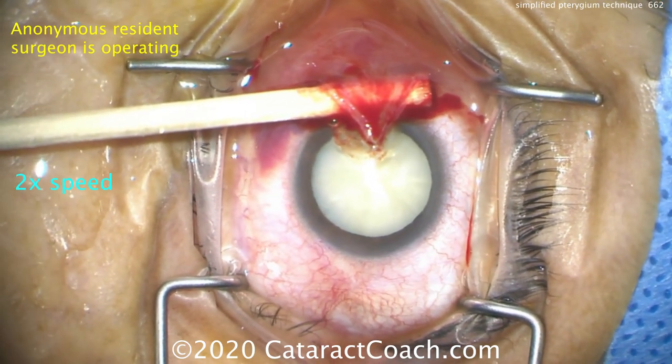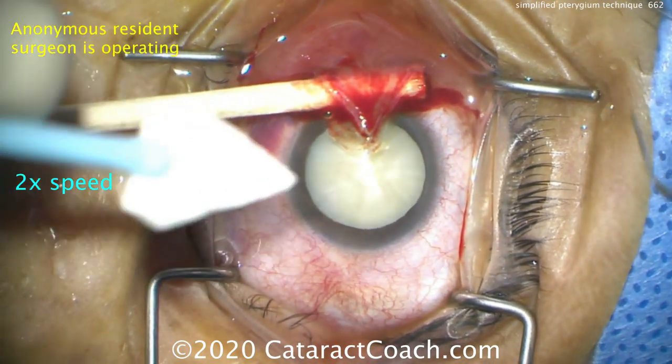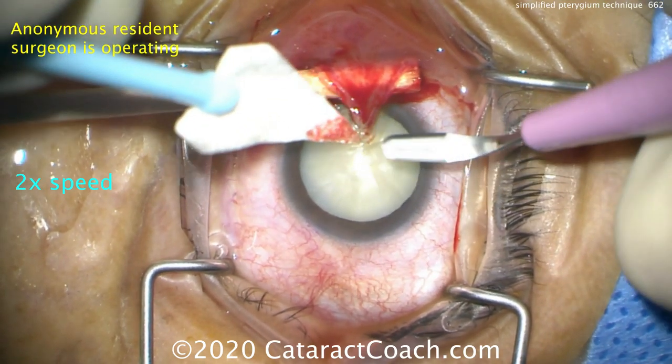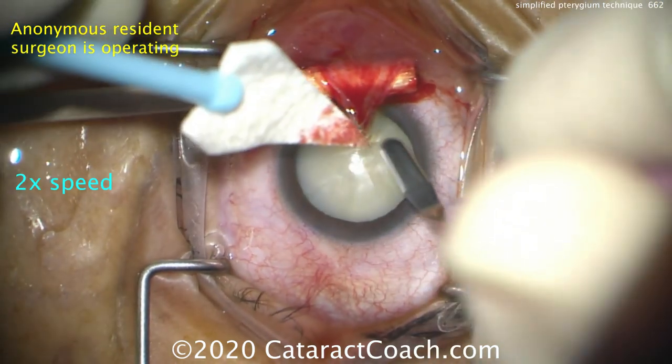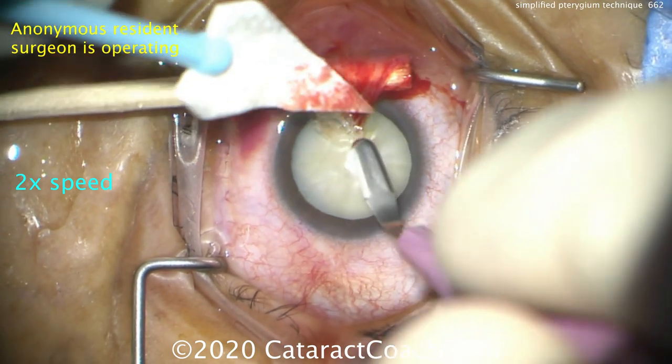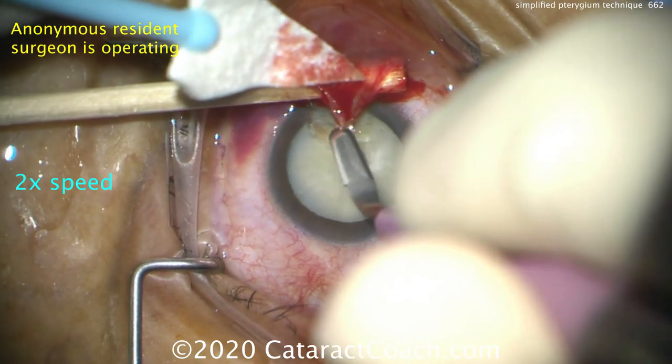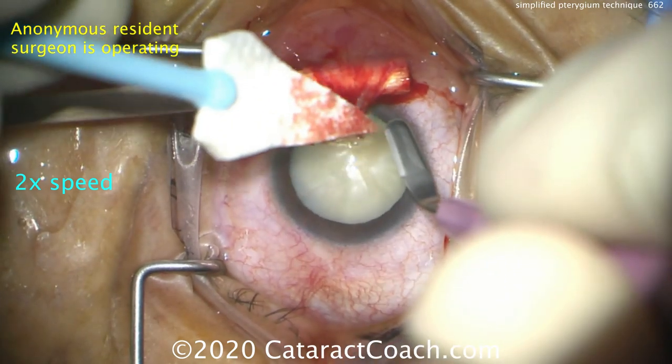Now we can just use our crescent blade and find a very clean single plane to dissect this off and have one clean plane. You want to preserve as much of the corneal stroma as possible — just get barely underneath the pterygium, just like that, with simple motions back and forth.